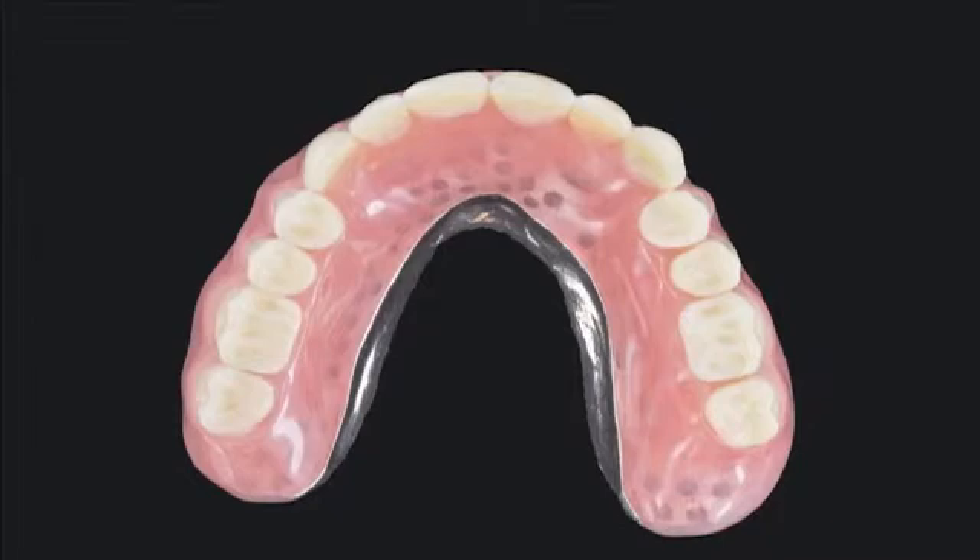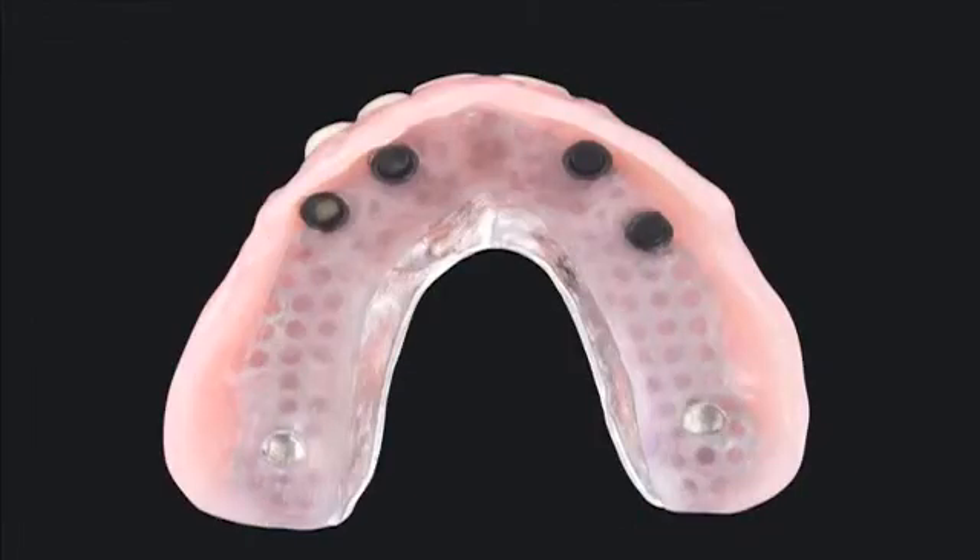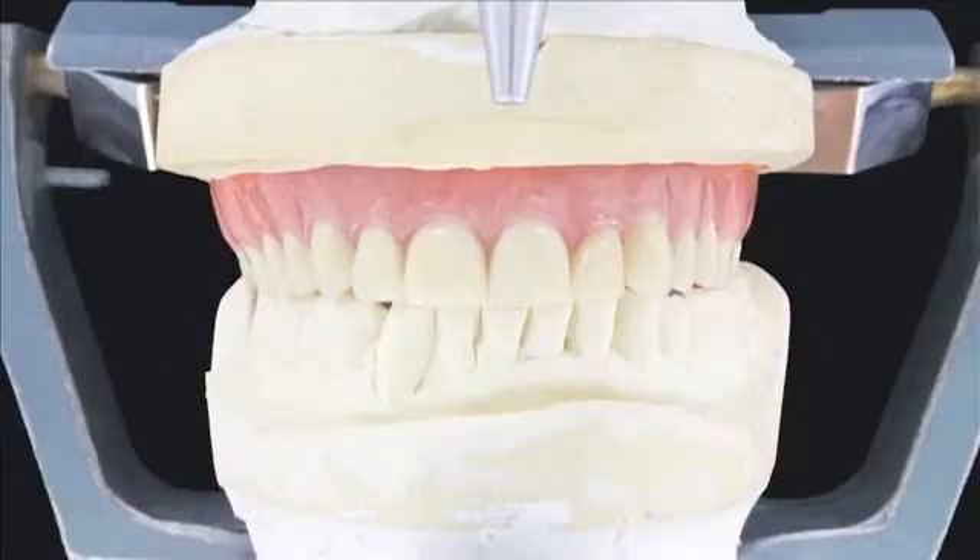The metal framework provides reinforcement and resistance to fracture for the horseshoe-shaped implant-retained overdentures. I prefer to have a metal mesh framework in my horseshoe-shaped overdentures for long-term stability. If you just make it out of acrylic, the maxilla will flex a little bit and sometimes you will see fracturing or cracking of the horseshoe-shaped overdenture. So use a wire mesh to reinforce it.